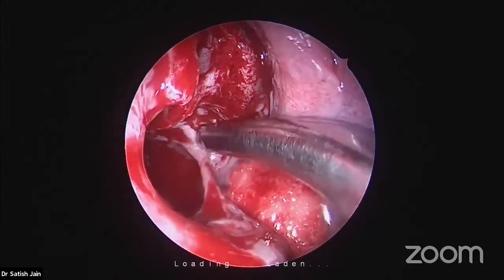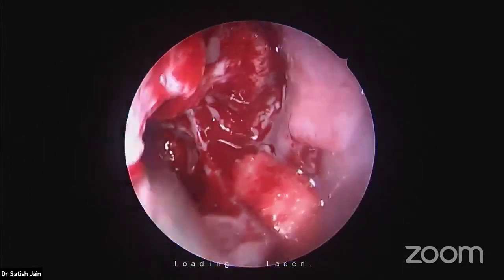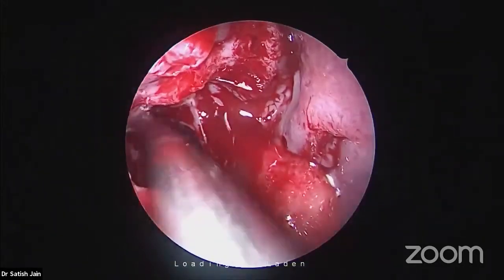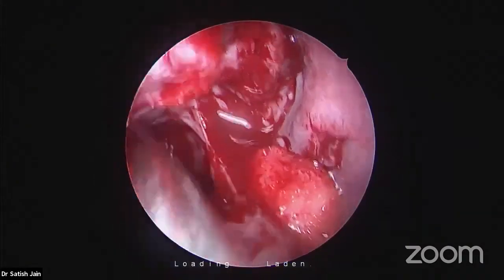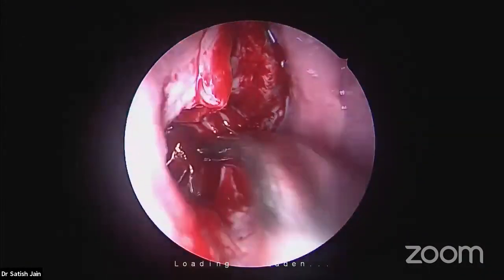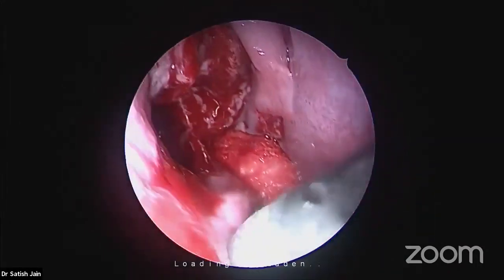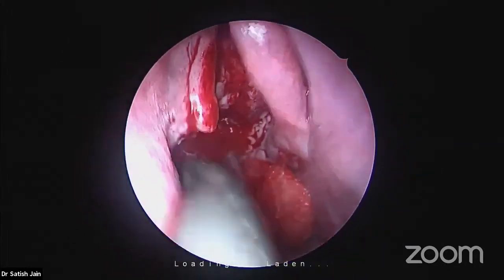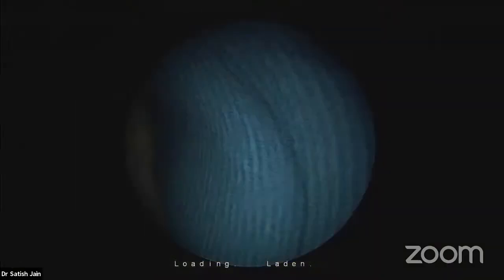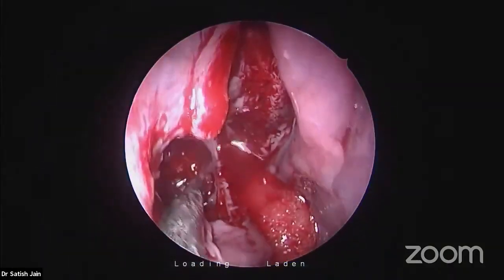Dr. Satish: Yes, sir, for sinonasal polyposis, the concept is now growing very well regarding this ethmoidal part and the maxillary part, that people are removing the middle turbinate and superior turbinate entirely to prevent further recurrence of the polyp. How do you see this? Removal of the middle turbinate is a great idea in certain situations.